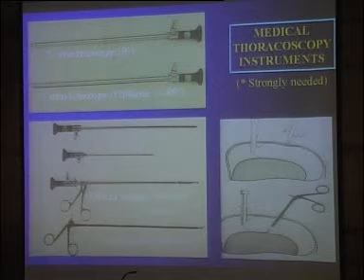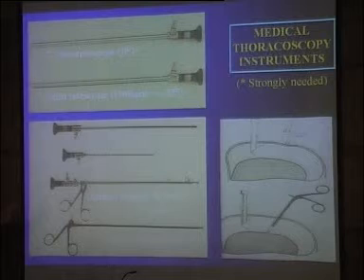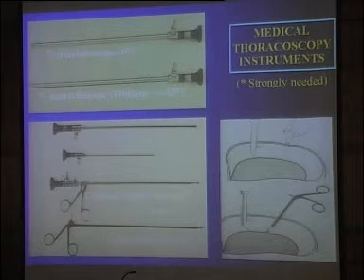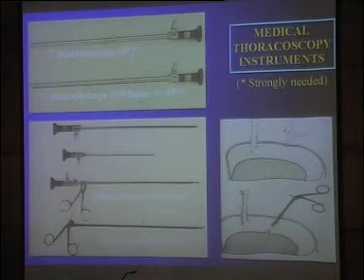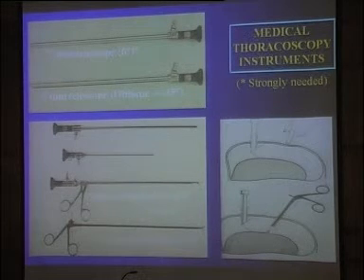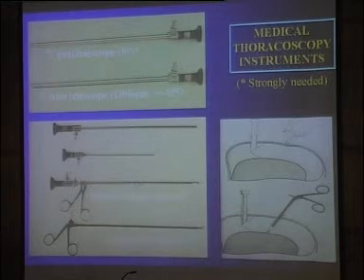So how can I take the biopsy under vision if I remove the telescope out and enter? Because this is vision here. There is a lens, a telescope inside. It's optical biopsy forceps. I mean, there are two pieces. There is a forceps here, and this telescope you put inside, and in total you put it in the second point of entry here. You understand?